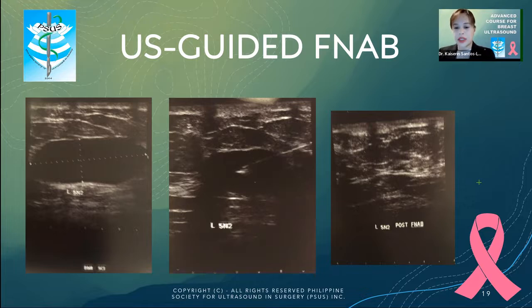As mentioned, the advanced course this afternoon will have demonstration units on hands-on and a return demo with evaluation on the two widely used percutaneous procedures. It's our ultrasound-guided fine needle aspiration biopsy. It is actually mostly used for both diagnostic and therapeutic purposes of our cystic nodules.